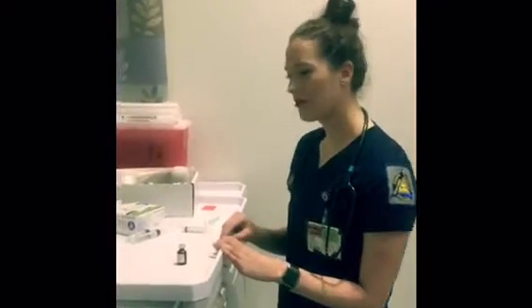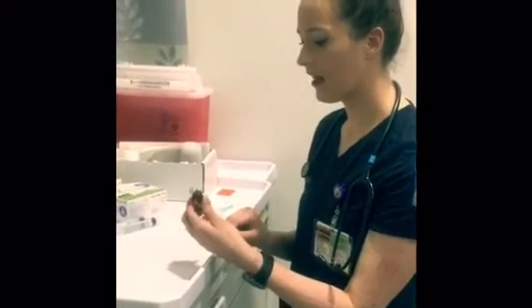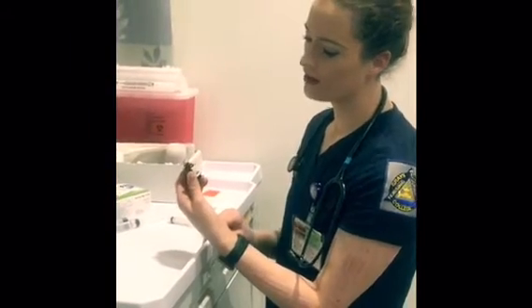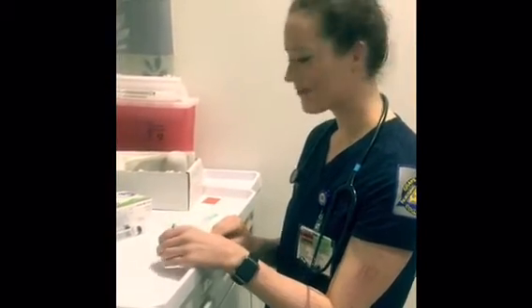Alright, so I am in the med room and I noticed my patient has an order for 40 milligrams of furosemide given IV. We have a bottle that is 10 milligrams per milliliter, so I'm going to need to draw up 4 milliliters for them.